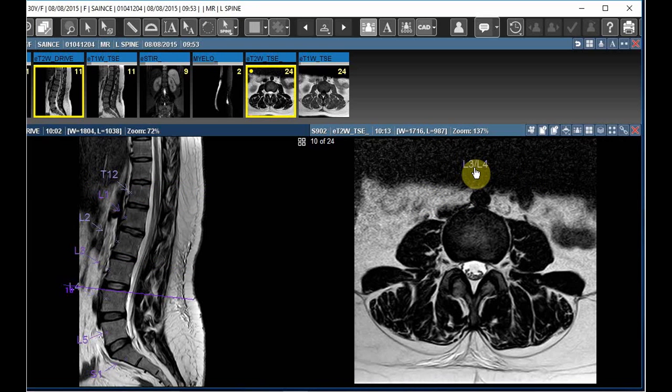This is about the Spine Labeling Tool. It will save the time of the technicians and radiologists.